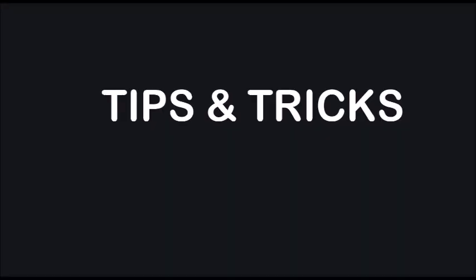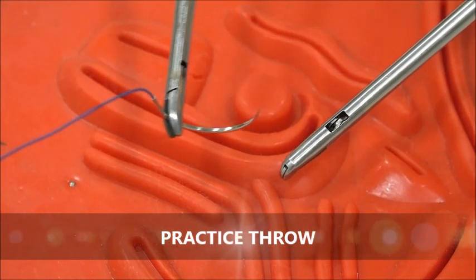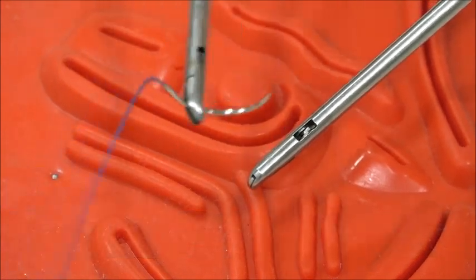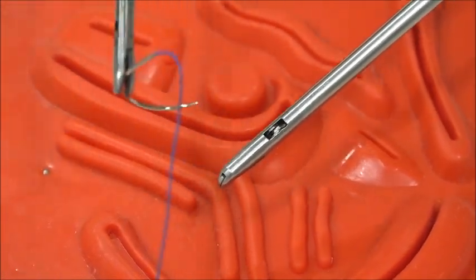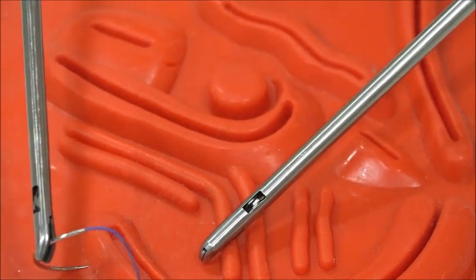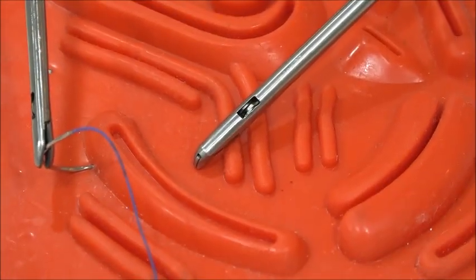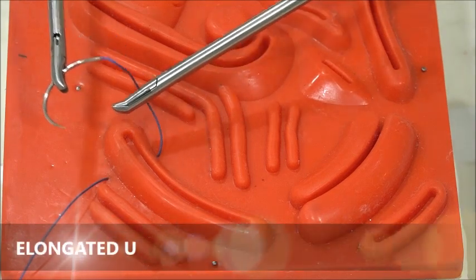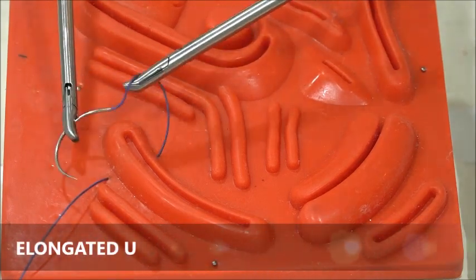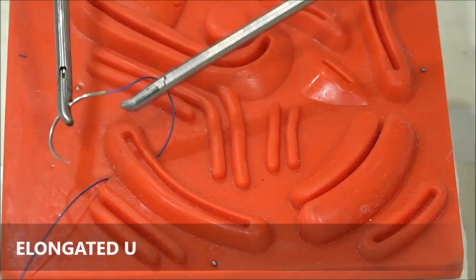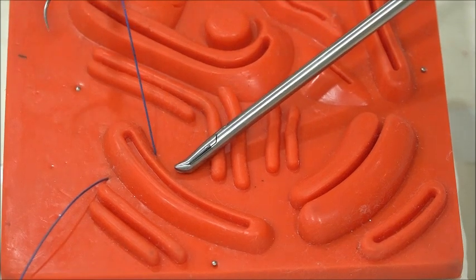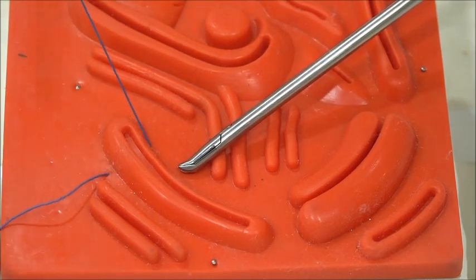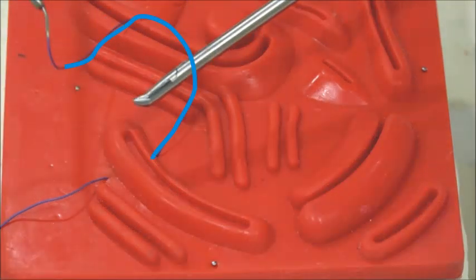Take home message or tips about laparoscopic suturing. First is, needle direction should be 90 degrees to the needle holder and 70 degrees to the tissues. See, the struggle is there in the figure—the very small C is formed. That's why the surgeon is struggling for the knotting. Take a full C—elongated U or elongated C—and the left instrument should be constant.